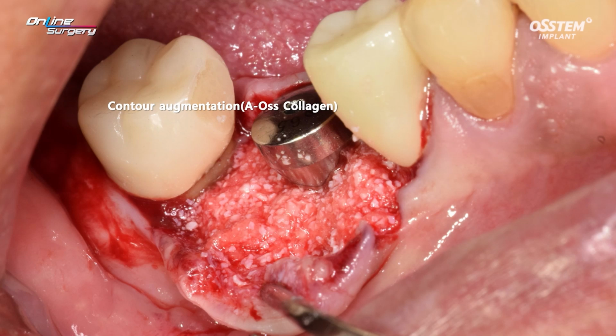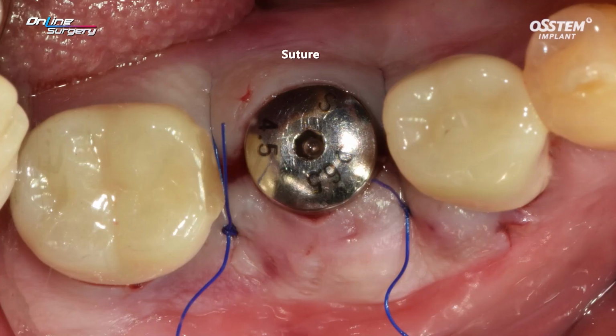It makes surgery very easy. Interrupted sutures were made, two of them in the proximal area. The ISQ was about 75, which is good stability, so it was finished with one-stage surgery.